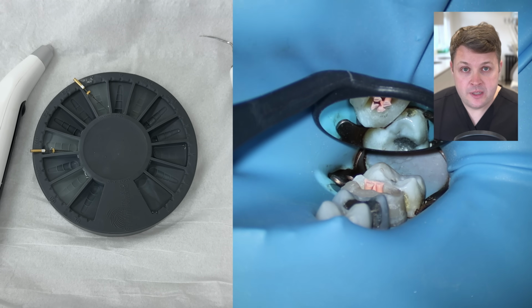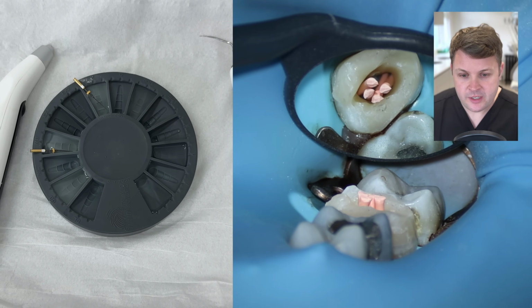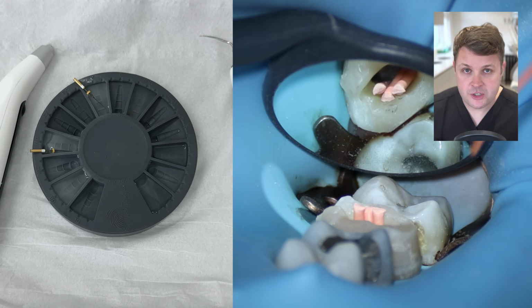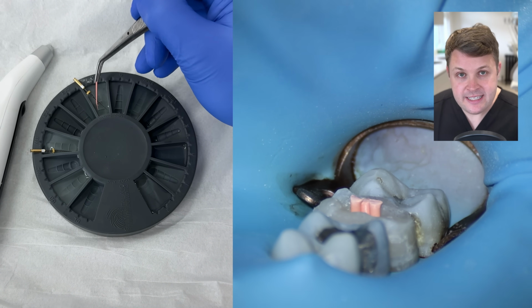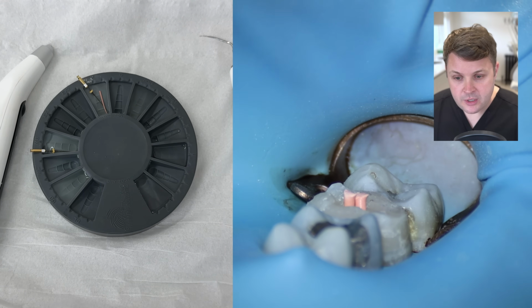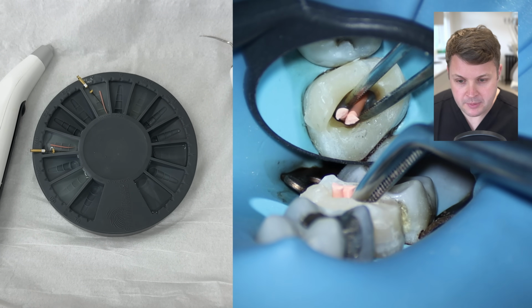Once we're happy with the cone fit radiograph, I'm going to remove the GP cones and place these into the disinfection ring. Remember, the GP cones are not sterile, they're just sloshing around in a GP box, so they need to be disinfected with sodium hypochlorite. But of course, when we come to place these cones, the sodium hypochlorite needs to be washed off. So before we place these, we're going to dip them into isopropyl alcohol.